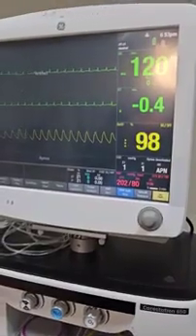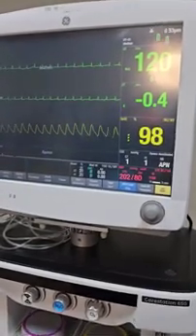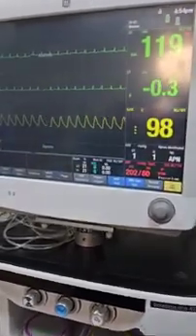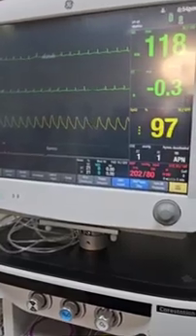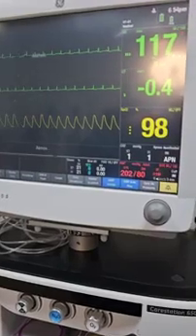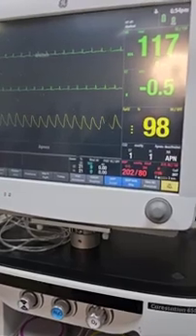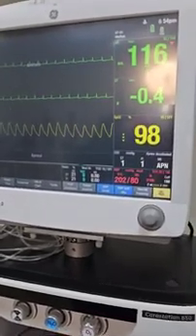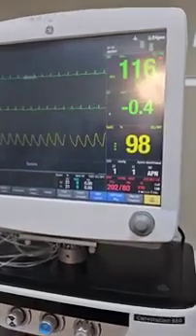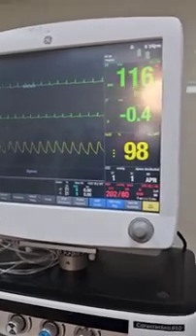Okay, welcome back friends. We are seeing that our blood pressure is 202/80, mean pressure of 115. It is 3 hours after the last measurement, but heart rate was slightly around 115 to 120. So after giving 1 ml of ephedrine, it is almost similar, but with the increase of vessel resistance, the blood pressure rises.